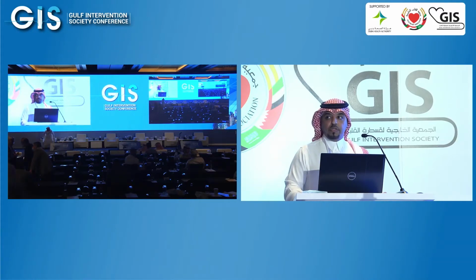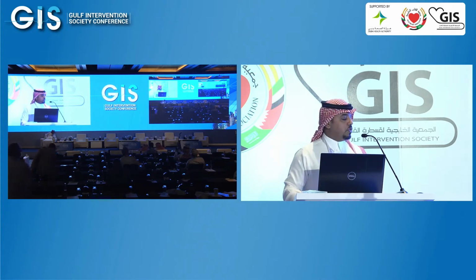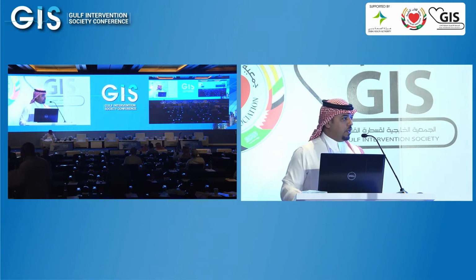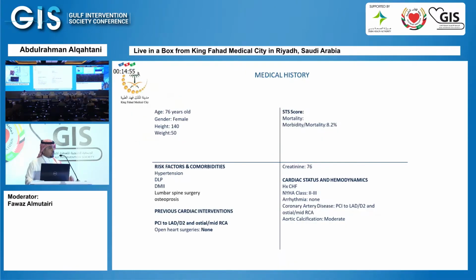Good afternoon, everyone. My name is Dr. Abdulrahman Alqahtani. I'm the head of interventional cardiology at King Fahad Medical City. I'm presenting live in a box. It's a TAVI case, along with my colleague, Dr. Fahad Alqahtani, who's an interventional cardiologist as well. Are we good to go ahead with the slide? Okay. So I will go quickly through this because the video will start afterwards.